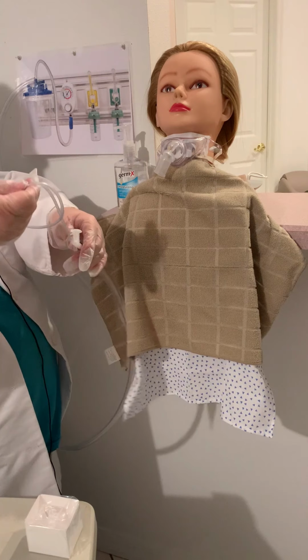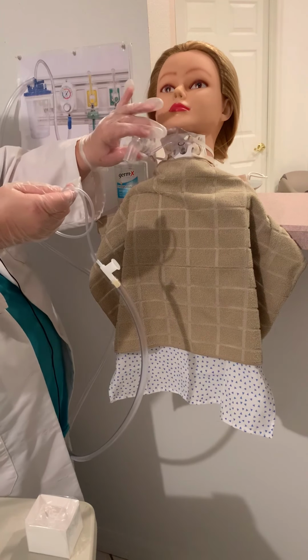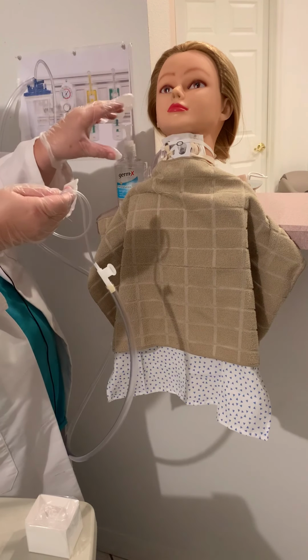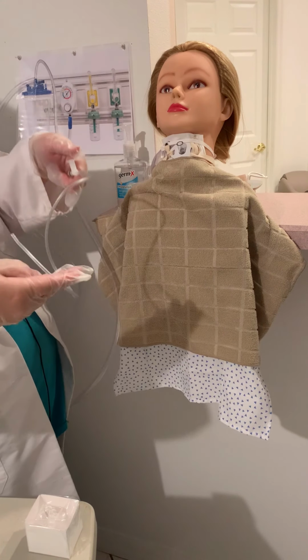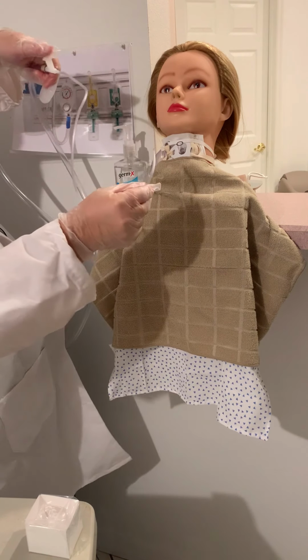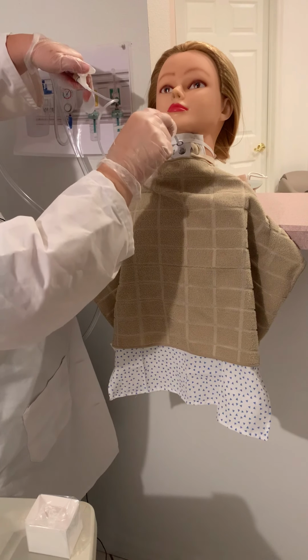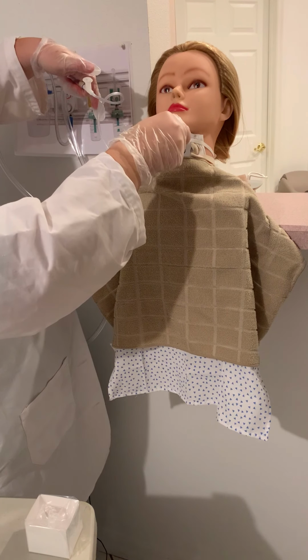So I'm going to keep control of my tubing here. We're going to move this over. Again, if I had the ambu bag, I would go ahead and give two breaths. Okay, I like to hold this up high so I don't contaminate. So we're going to go down, put it in about 4 inches.